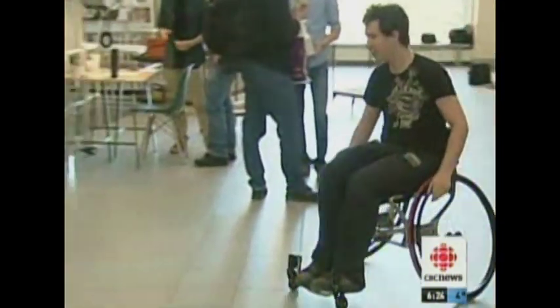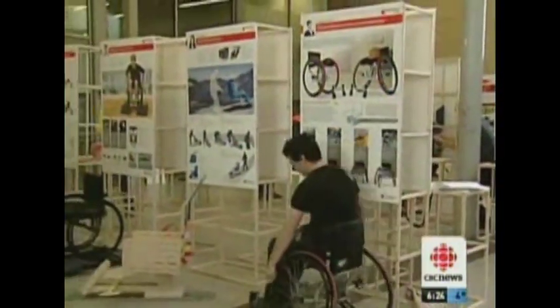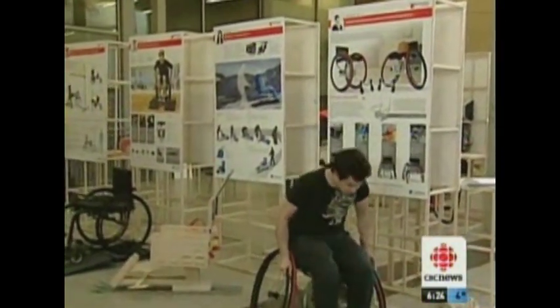Andrew Lowe has designed a cross trainer sports wheelchair that can convert from daily use to sports use. Lots of government funding grants are available for wheelchairs for daily use, but not so much for sports use. So having a chair that can quickly convert to play tennis, basketball, and track racing allows children to have greater accessibility into adaptive sports.